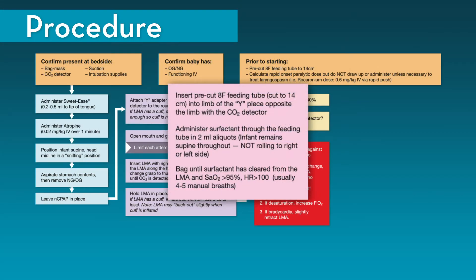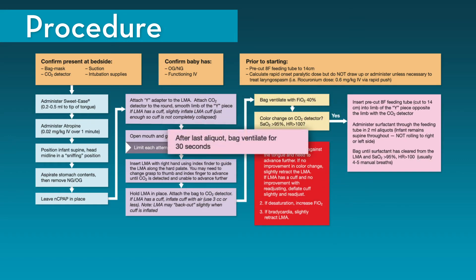Insert the 8 French feeding tube, which has been pre-cut to the appropriate length, into the Y adapter. This should be advanced in the limb of the Y adapter that is opposite the limb with the CO2 detector and bag. Administer surfactant through the feeding tube in 2 mL aliquots. The infant will remain supine throughout the procedure and will not be rolled to the right or left side. After each aliquot, bag ventilate until surfactant has cleared from the LMA, oxygen saturations are greater than 95%, and heart rate is greater than 100 beats per minute. It usually takes 4 to 5 manual breaths to clear the surfactant from the LMA. After the last aliquot, bag ventilate for approximately 30 seconds.